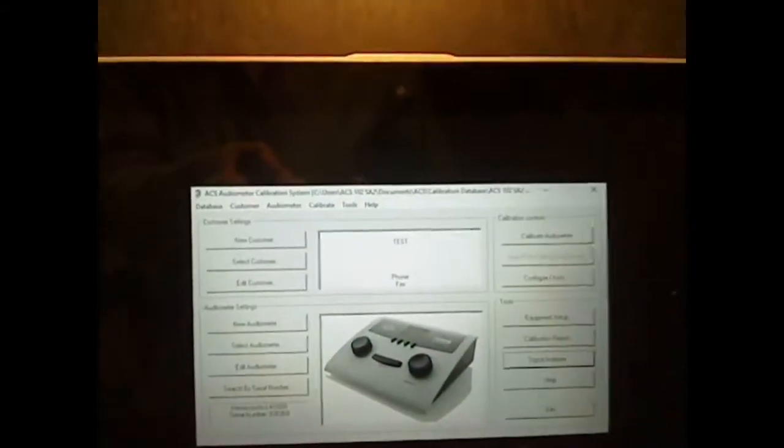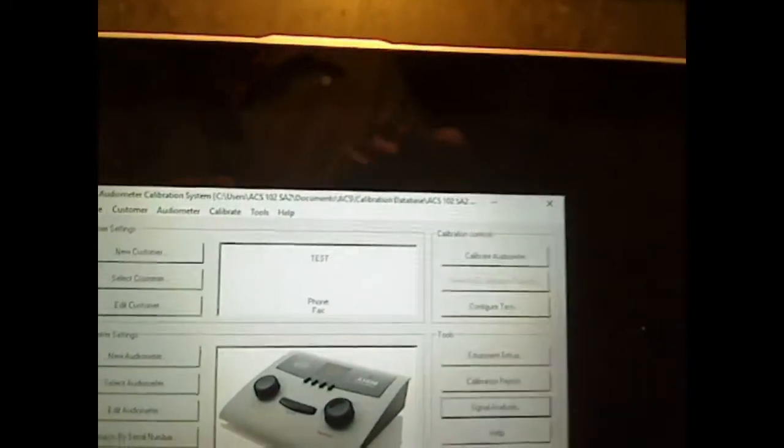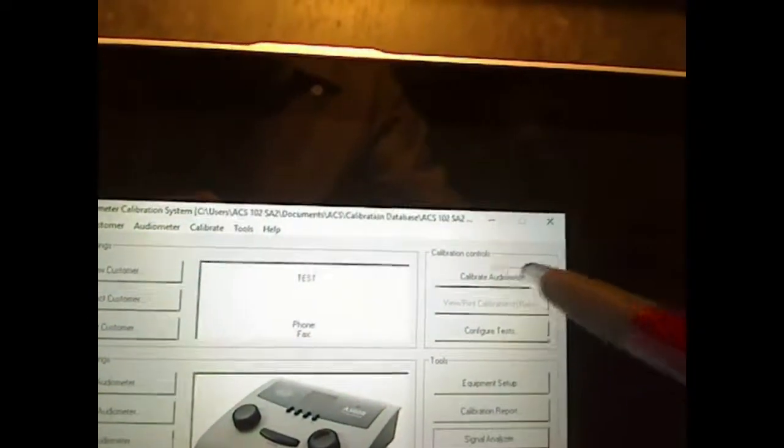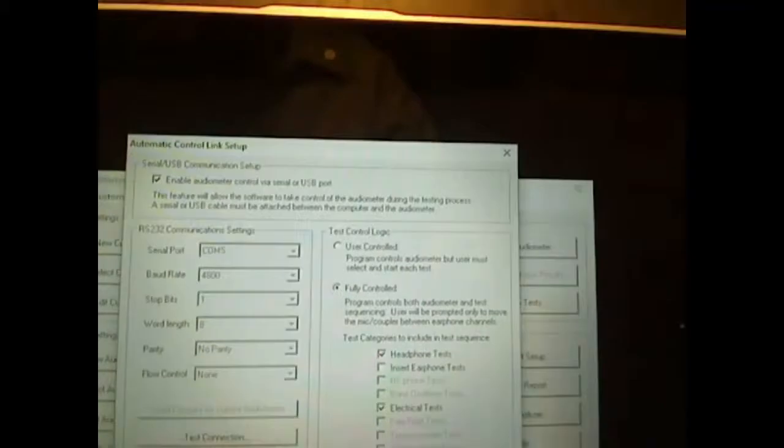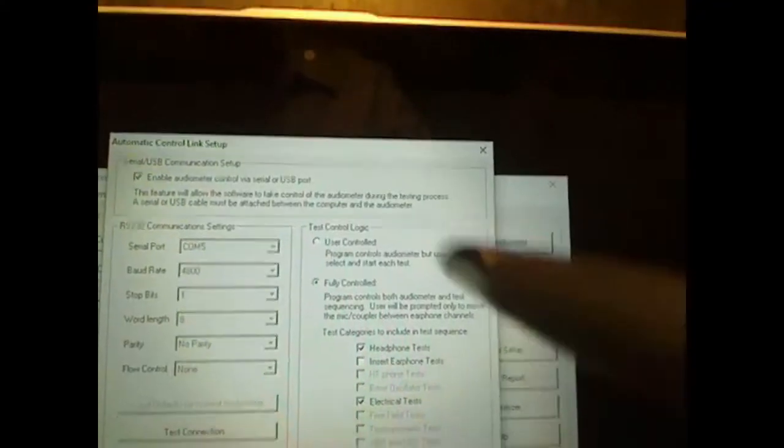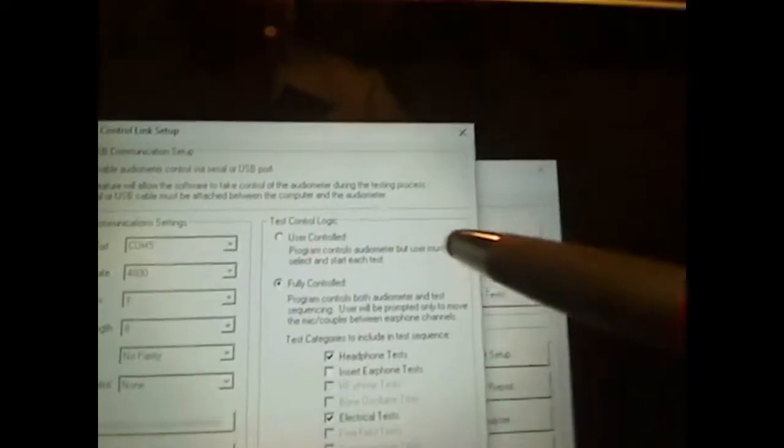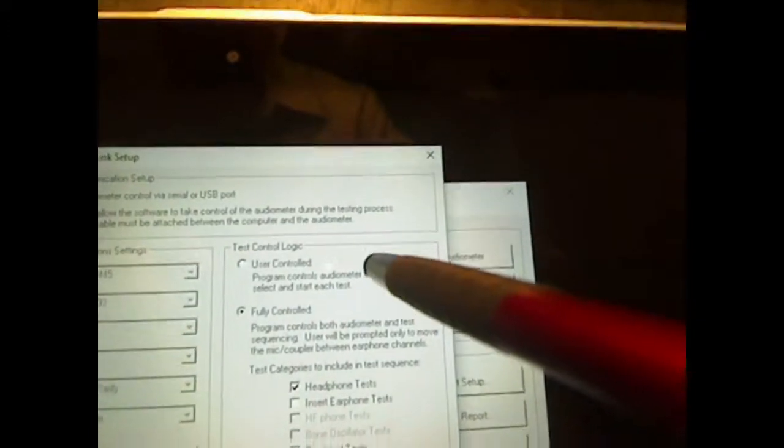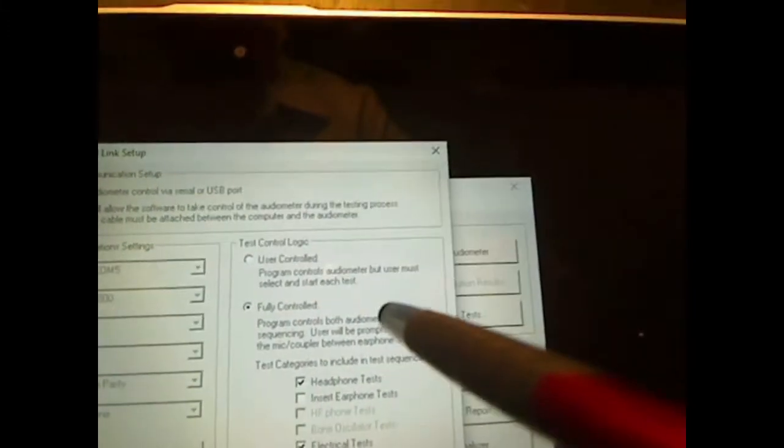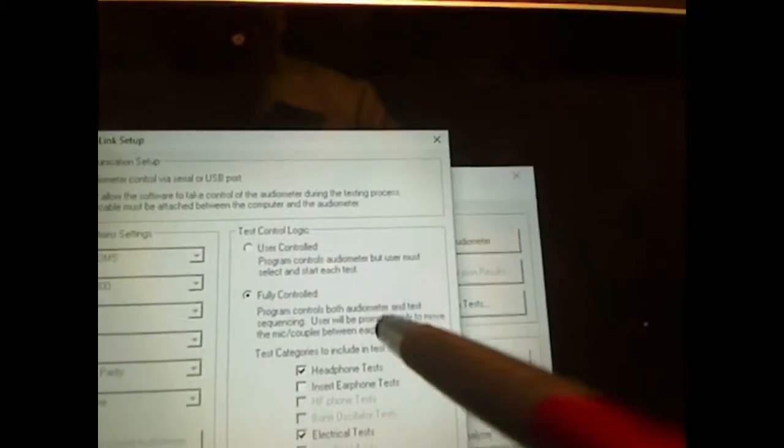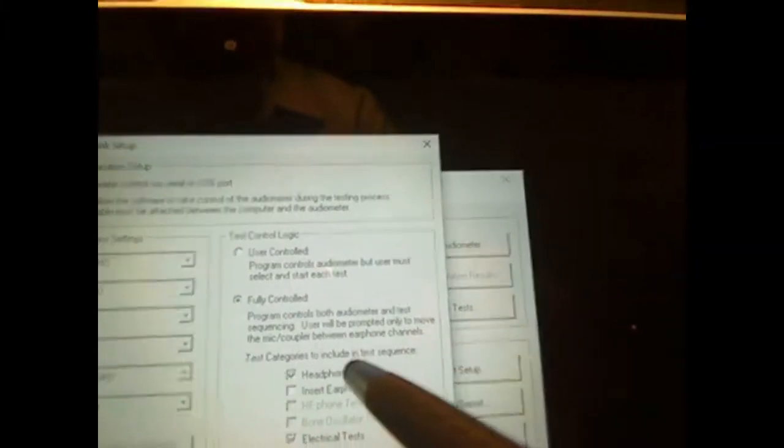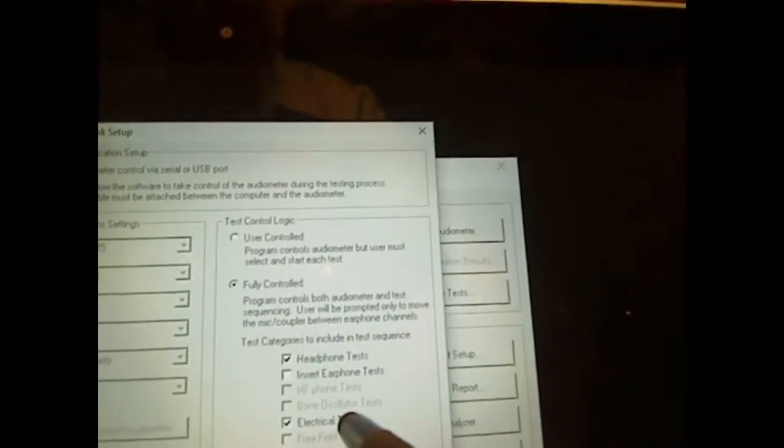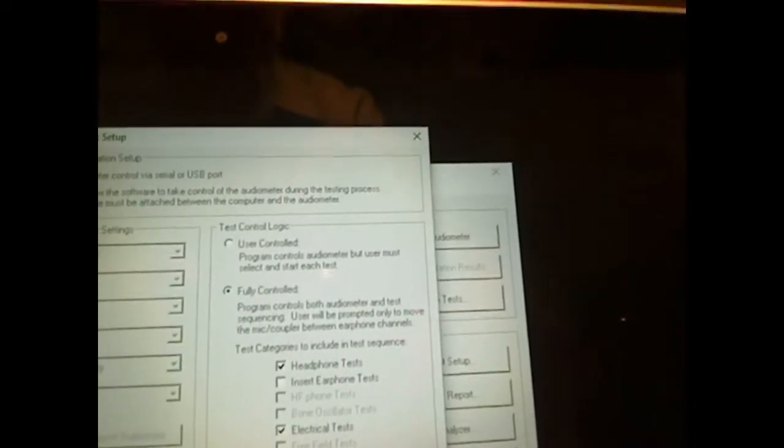Come back up over here. See the screen? I'm simply going to come up over here. I'm going to calibrate the audiometer. Gives me some choices of making an interface over here, which is of no concern right now. User control, fully control. I'm going to do the headphones and I'm going to do the electrical portion.